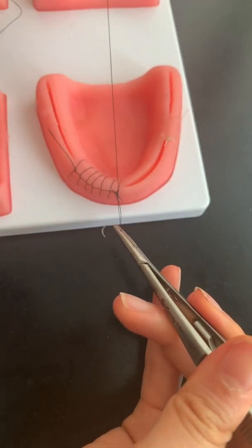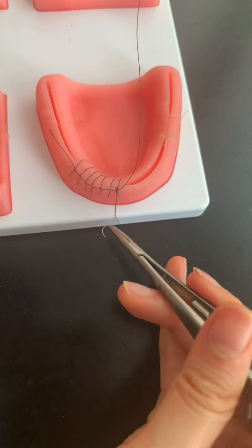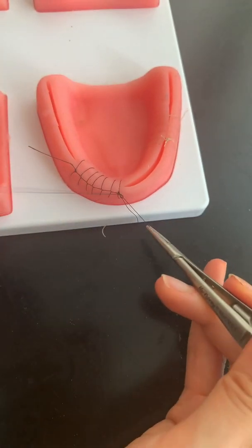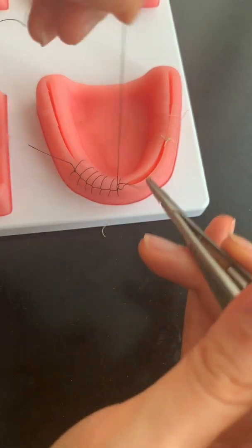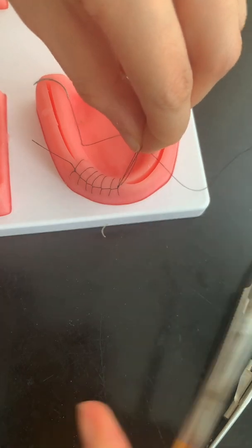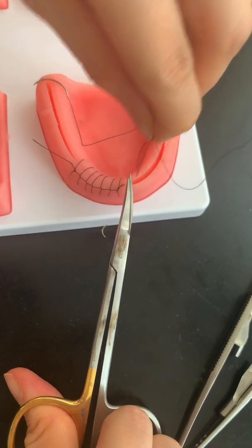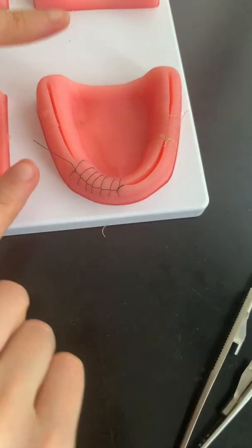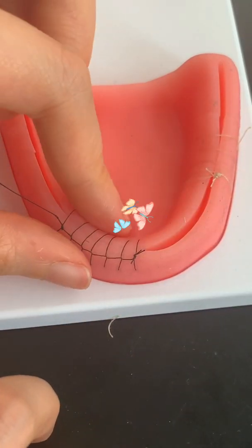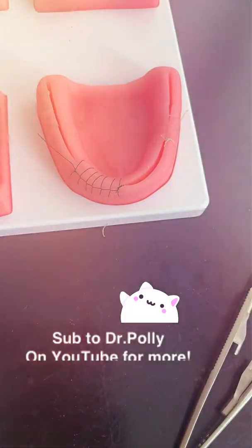Another round. There you go, and one last one. Ta-da. And you just cut this off. Isn't that pretty? It's the prettiest suture, I think. It's the continuous interlocking suture — so there you have it.